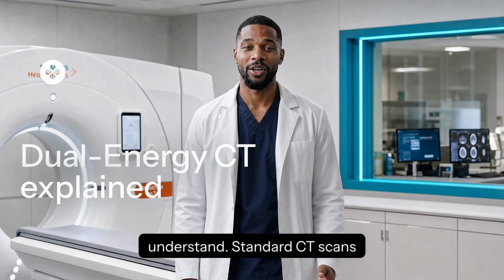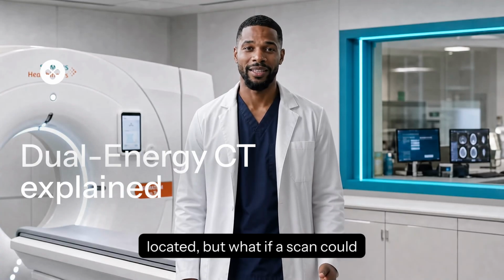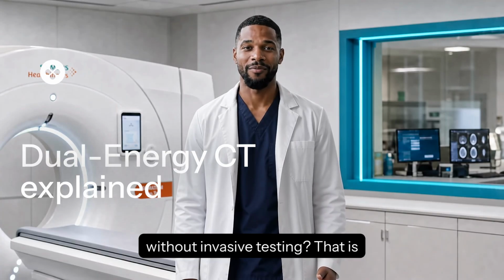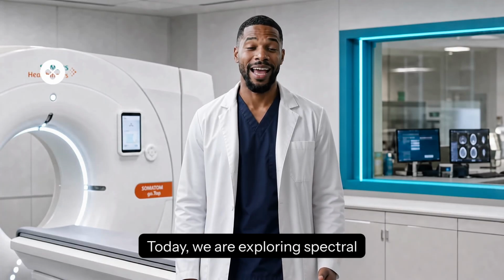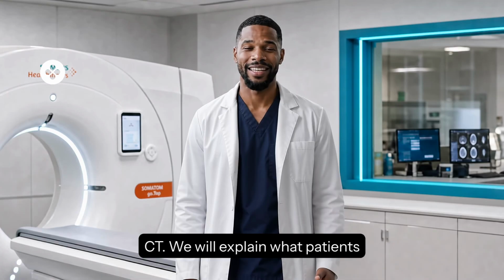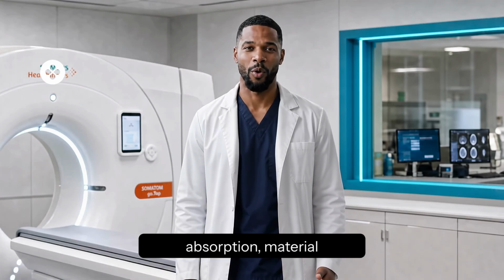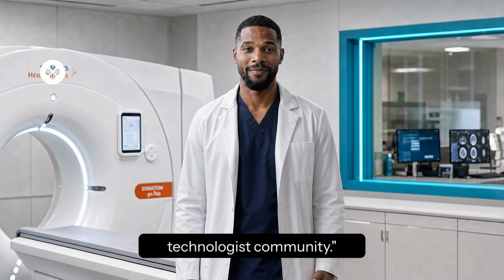Standard CT scans are fantastic at showing us where a kidney stone or joint crystal is located, but what if a scan could tell us exactly what it is made of without invasive testing? That is the power of dual energy CT. Today, we are exploring spectral CT. We will explain what patients experience during material characterization scans while breaking down K-edge absorption, material decomposition algorithms, and dual-source physics for our technologist community.